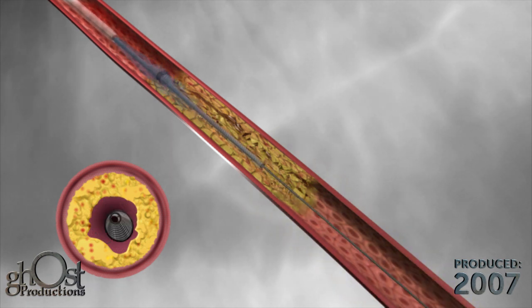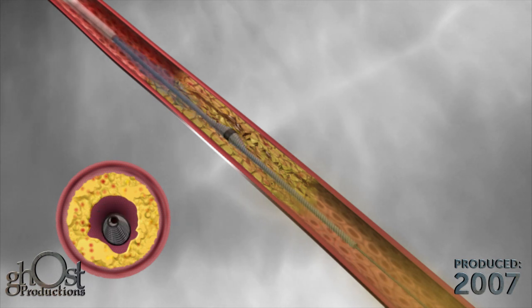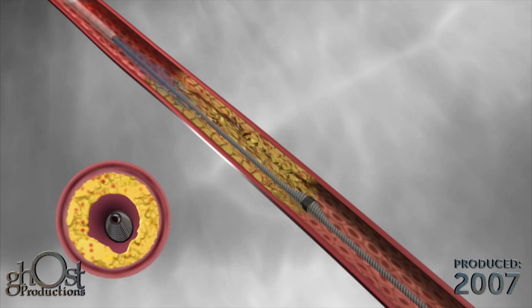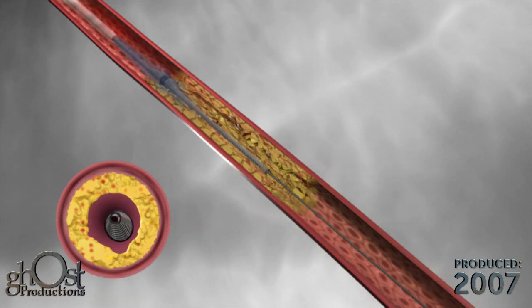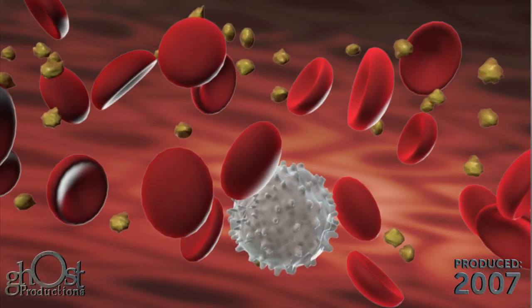The Diamondback 360 treatment is initiated at a low orbital speed. Using the device handle, the crown is advanced through the lesion then retracted proximally. Plaque is sanded in both directions with each pass of the crown. With each successive pass, the amount of particulate diminishes as the lesion is sanded and reduced.